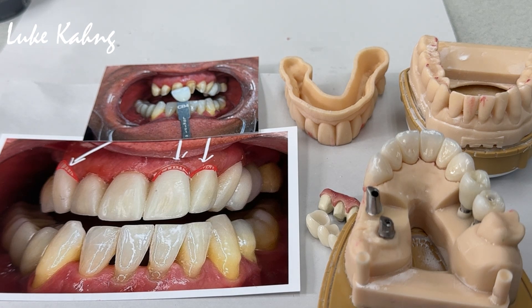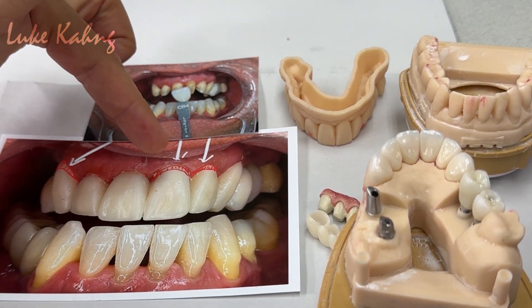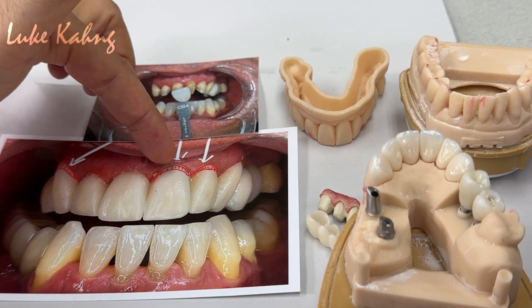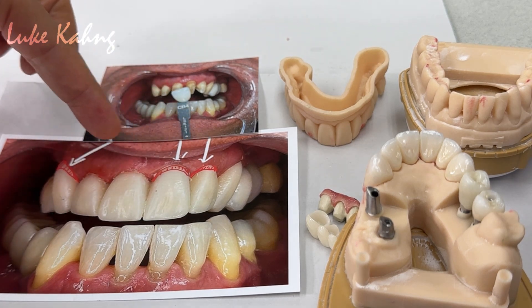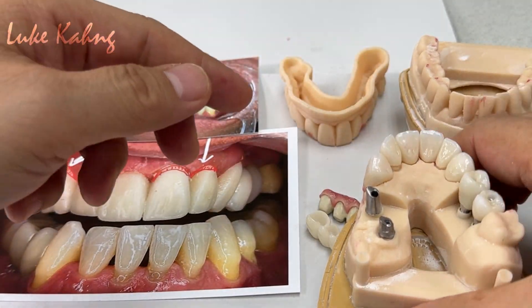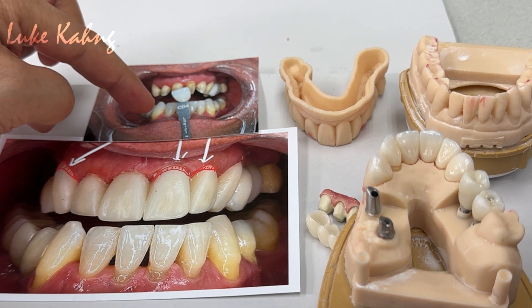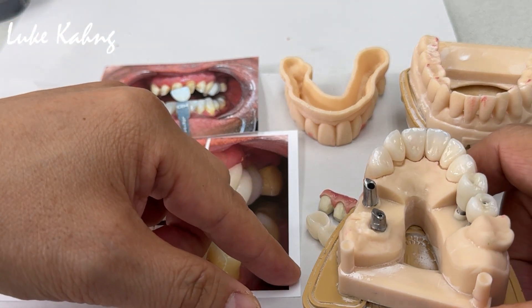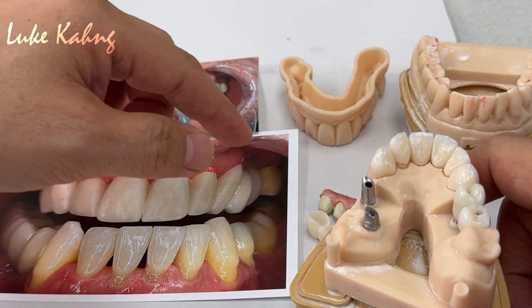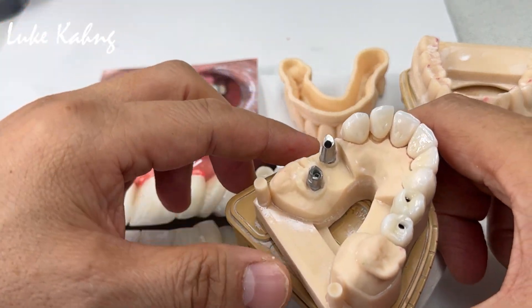The final full mouth case — which is a great case. The doctor gave us the information regarding the photo, and we had to make the pink porcelain here. Here is the shade guide — our chairside shade guide system — and the CB4, which is a bleaching color and a great communication tool.